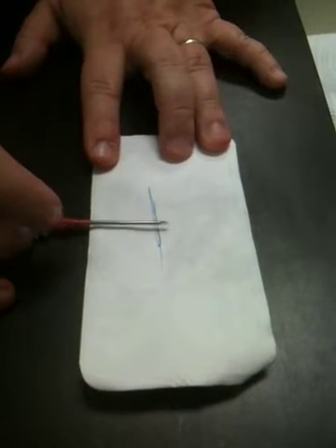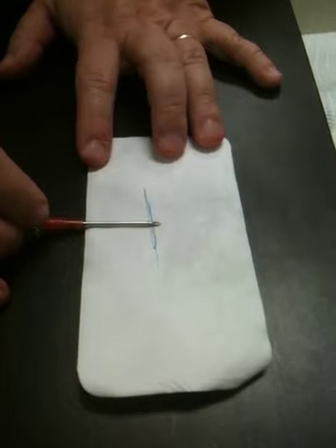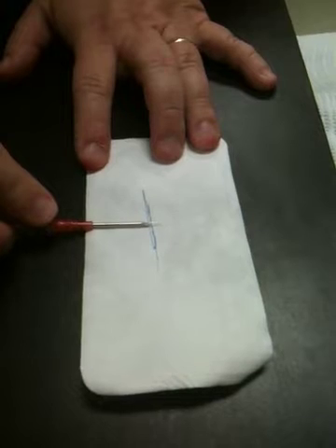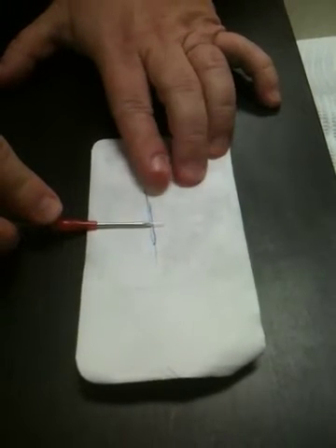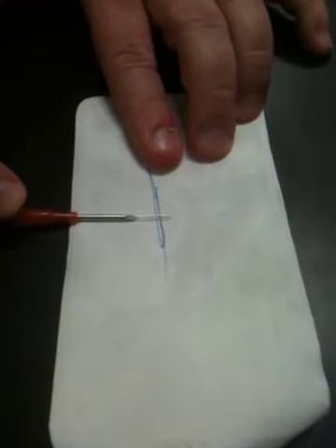What a lot of people have a tendency to do is that when they get to this point they're wanting to pull the needle back. So here's your cannula and we're pulling the needle back. See the cannula is not going anywhere. It's staying right where it's at and we're pulling the needle back.